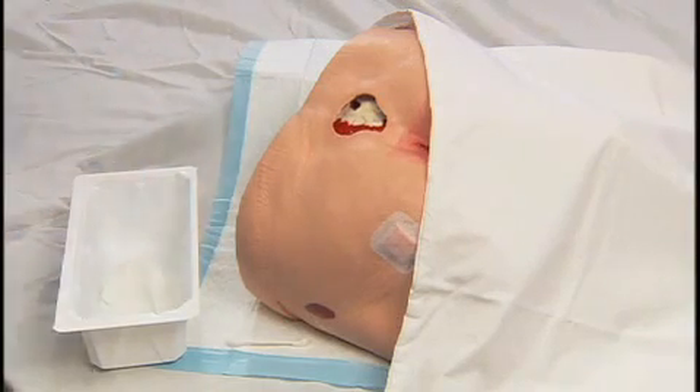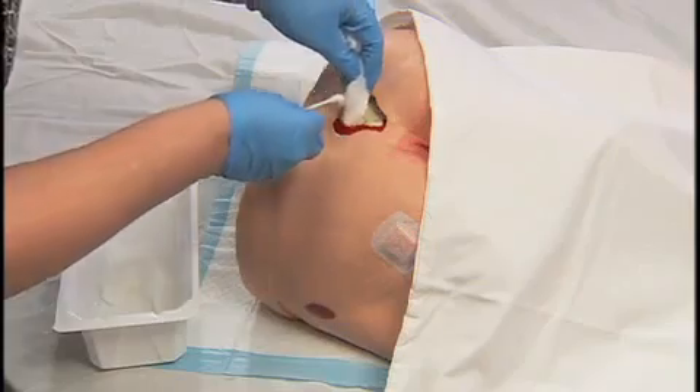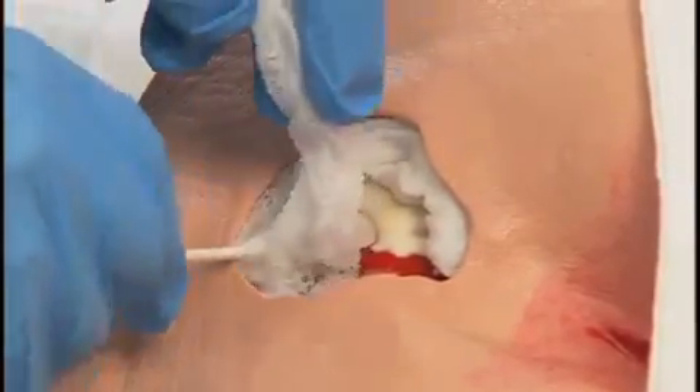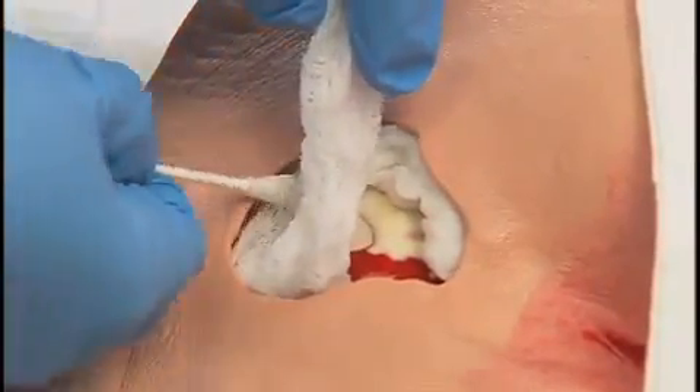Fluff and place loosely into wound beds. Avoid over packing. Tightly packing the wound causes pressure on the newly formed tissue and may cause damage.